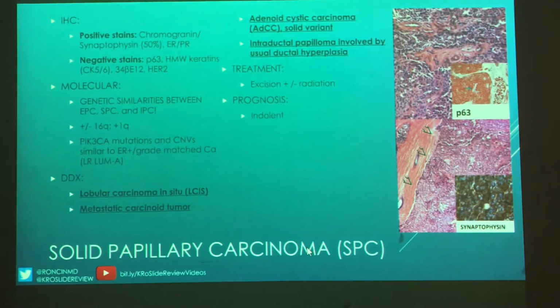Now, is there a reason why the myoepithelial cells are not always present? So, like with the papillary DCIS, you also don't see myoepithelial markers at your fibrovascular cores, but they'll still be at the periphery. Oh, I kind of see. That is what's helping you say this is in situ, right? But we see that with DCIS too, where you can have DCIS with microinvasion. So with this, you could also have invasion, even though it looks like it's well contained.